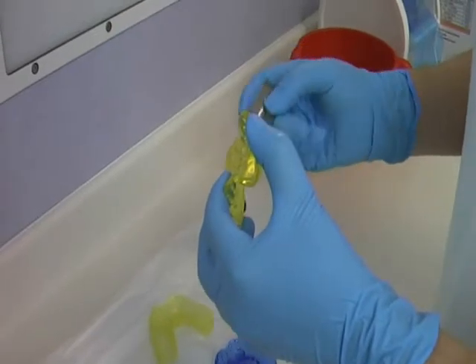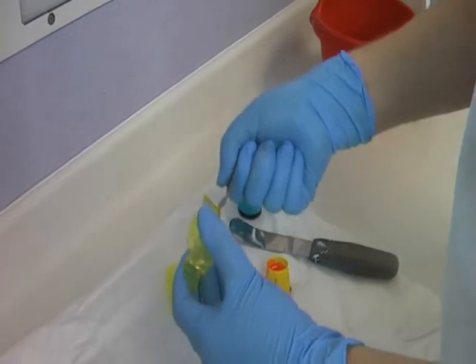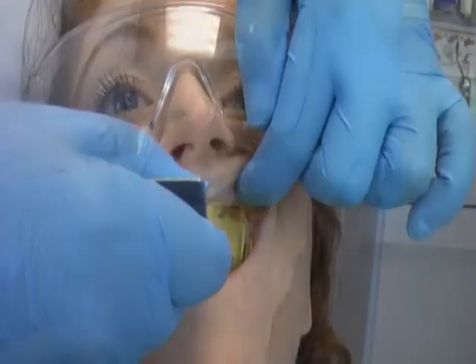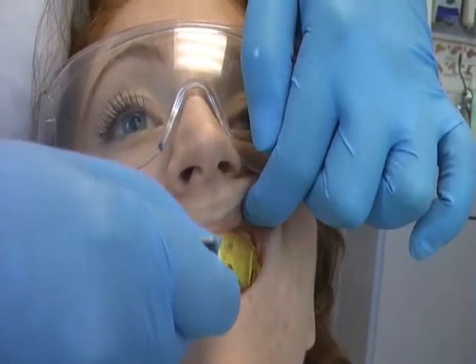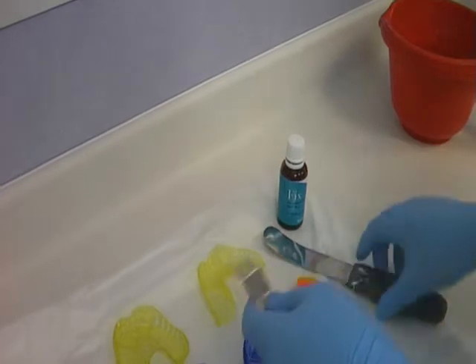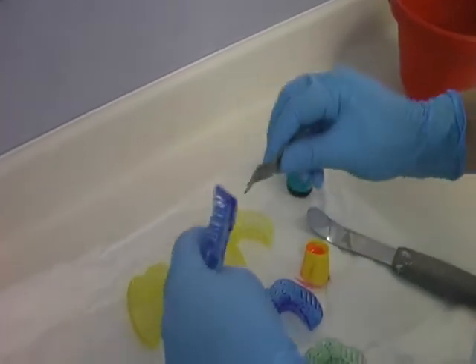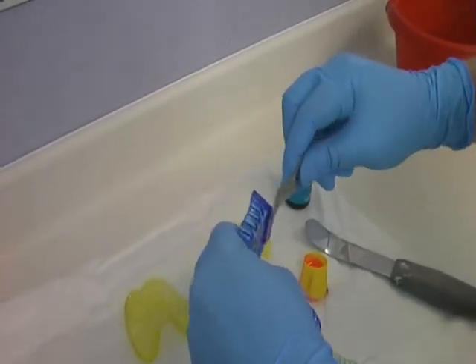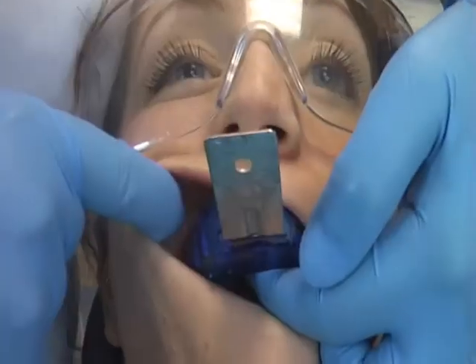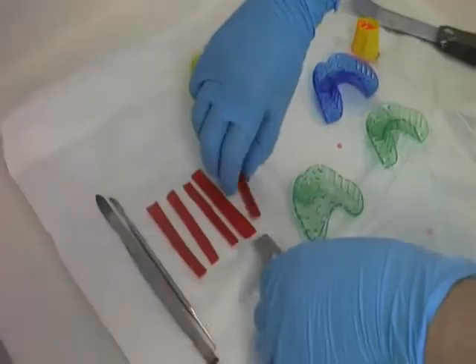Attach the handle to the stock tray ensuring that it is facing downward away from the lip surface. Before loading the tray you must try it in the patient's mouth. Ensure that it has been fully seated and check the extensions of the tray, particularly in the buccal sulcus. In the instance that the handle of the stock tray is loose you can use the alginate spatula to adjust the handle to achieve a more secure fit. Ensure the impression tray extends fully into the buccal sulcus on both sides, as this will allow you to take a detailed impression that will include all the relevant landmarks.